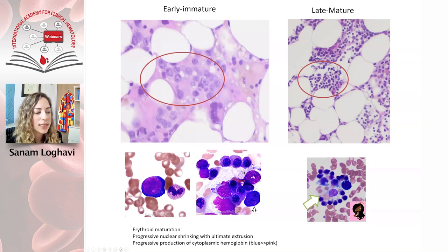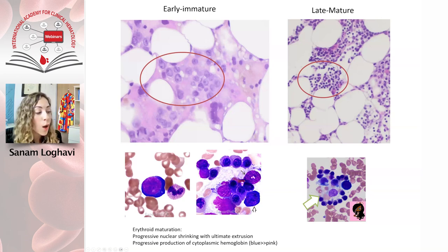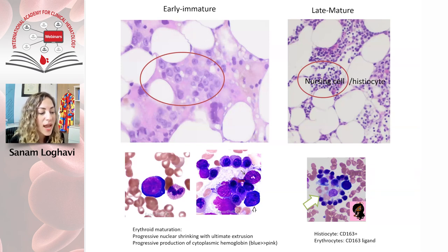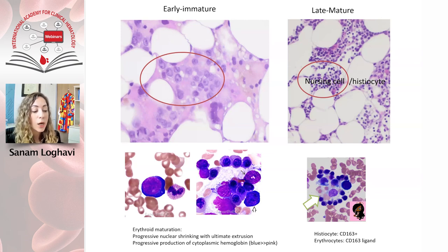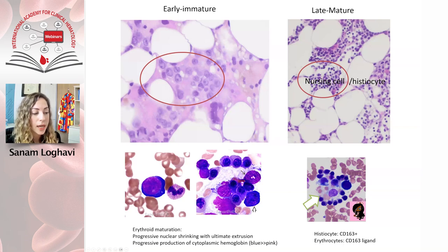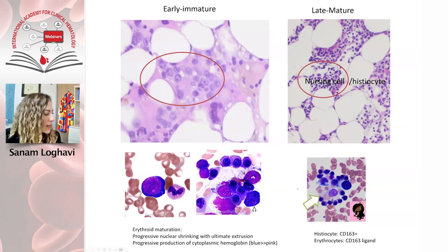I want to show you an example of a nurse cell. Nurse cells are histiocytes — CD163 positive — and erythrocytes have CD163 ligand, so they tend to populate around these cells. The reason they're called nurse cells is that we think these histiocytes are actually nursing the erythroid cells.